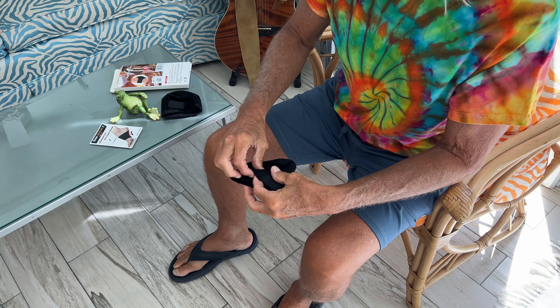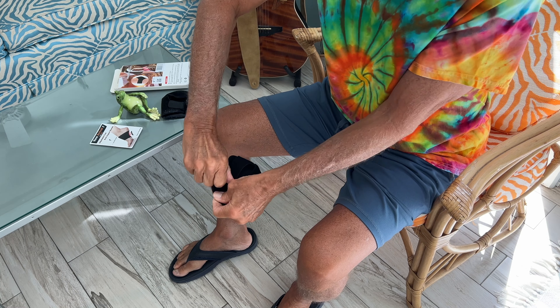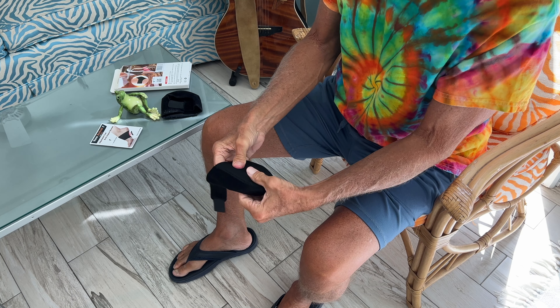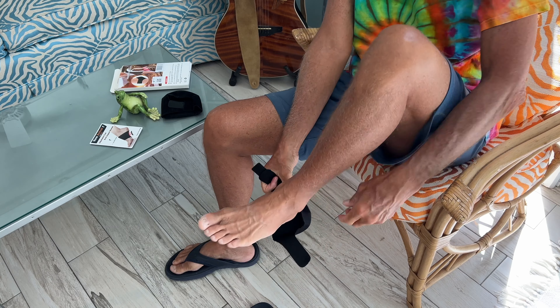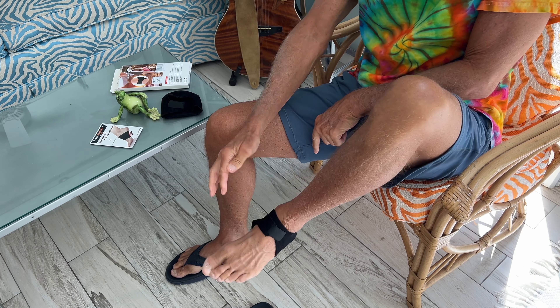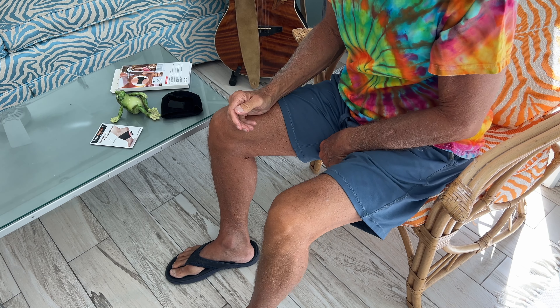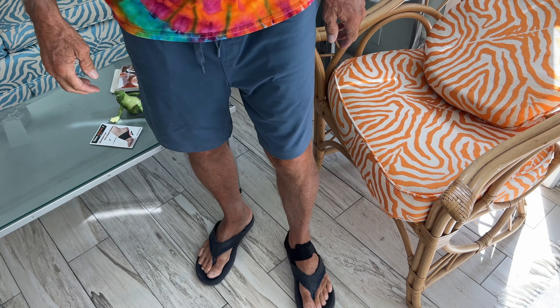So the way this works, it's got a Velcro here and you pull it off, and this is supposed to be a nice soft pad. It goes on your foot and your heel like this, and then this goes around like that.